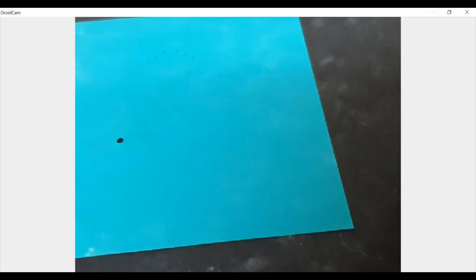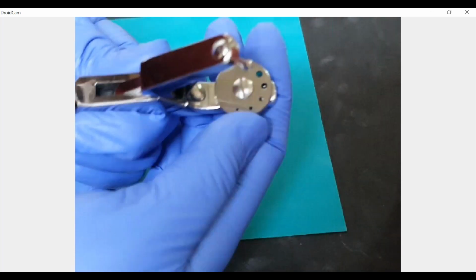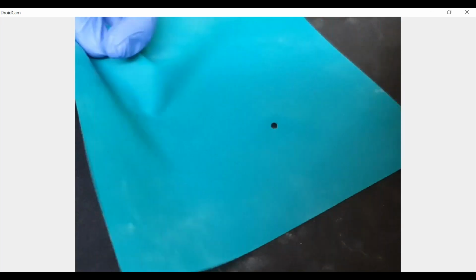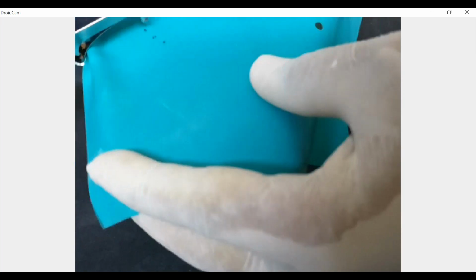So you can see that I have marked for the anterior isolation. Now, as we had decided, we will not go beyond the third hole for our punching. So we will stick to that. Again, make sure that you stretch it well and have a clean and neat punch.